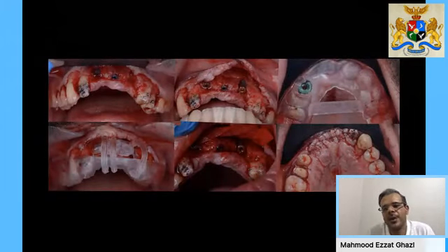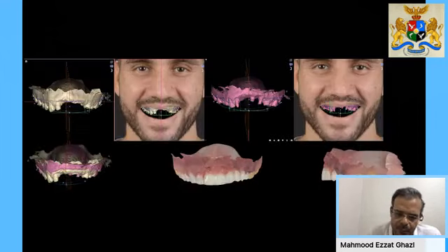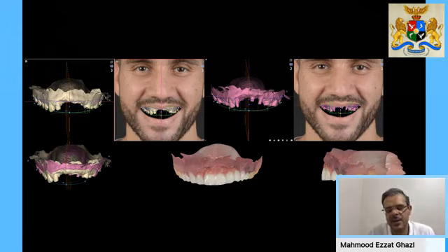And of course, with the bone regeneration and the soft tissue regeneration and closure of the flap, this was the guide to show us just the level that we needed to regenerate horizontally so that we can have a more favorable position. And this is the day of the surgery, the suturing. And we fabricated, of course, a temporary prosthesis for the patient so that we could train the gingiva, and the patient could not be left without temporization. Of course, the temporary was designed according to our final design for the patient.